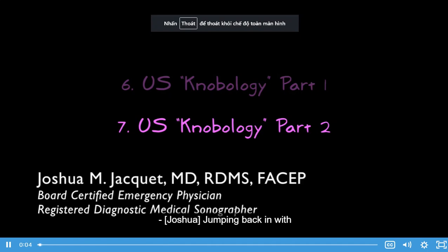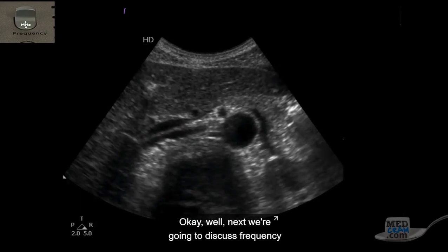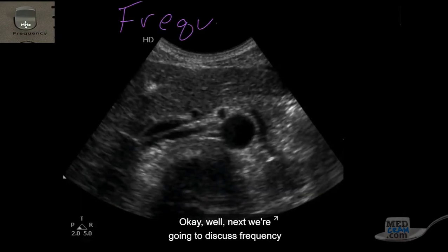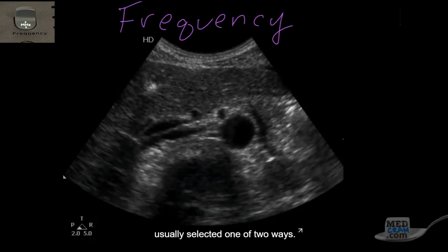Jumping back in with Ultrasound Knobology Part 2. Okay, well next we're going to discuss frequency. And frequency on the ultrasound machine is usually selected one of two ways.